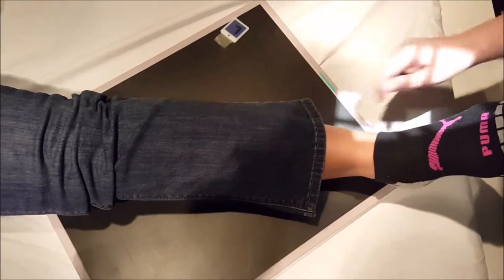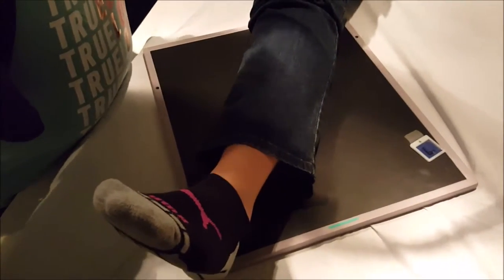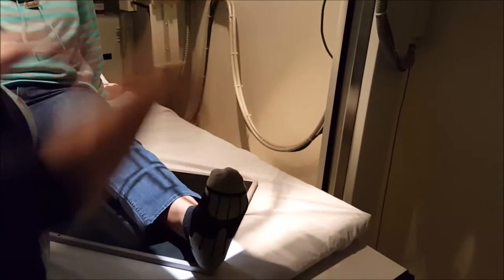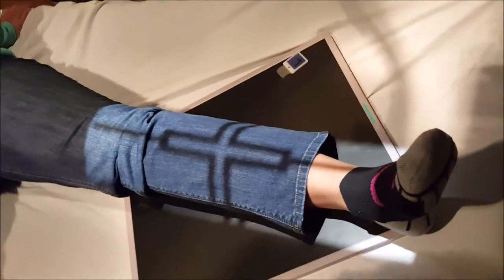We're going to center to the mid-tib fib. Now we're supposed to be at 40 inch SID, but that's not really going to work here. So what I'm going to do is I'm just going to increase my SID a little bit to kind of give me more divergence of the beam, just to help me out. So I didn't have to go up much, I went up 3 inches.